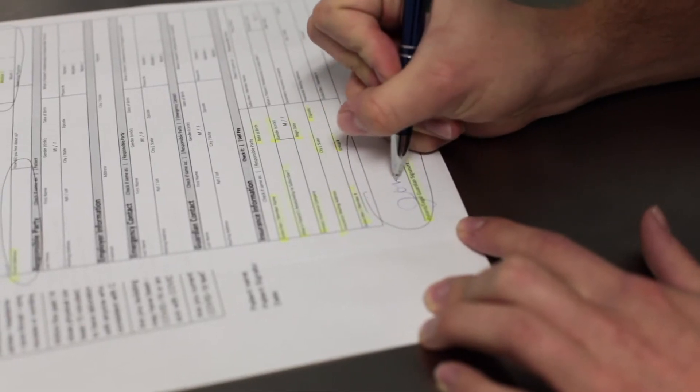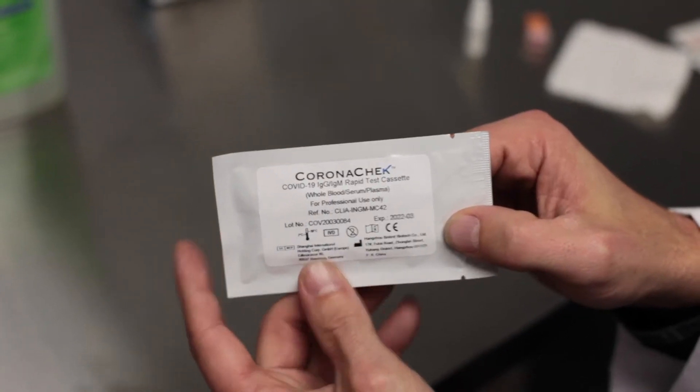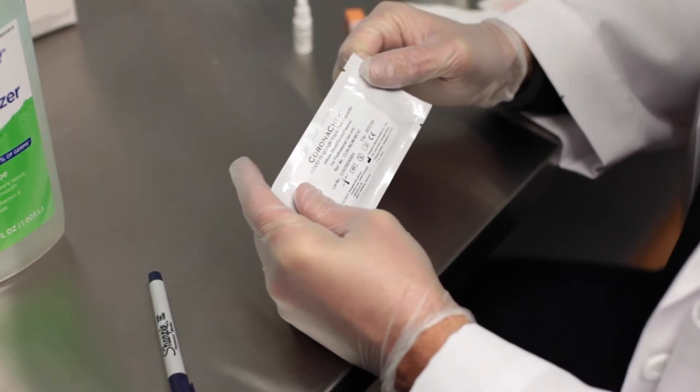To begin, make sure the patient has completely filled out all necessary forms. Gather your materials and check the expiry date of your kit. If it has expired, make sure to use another kit.